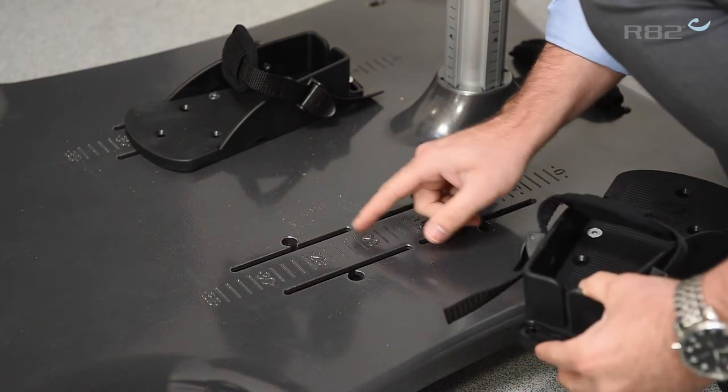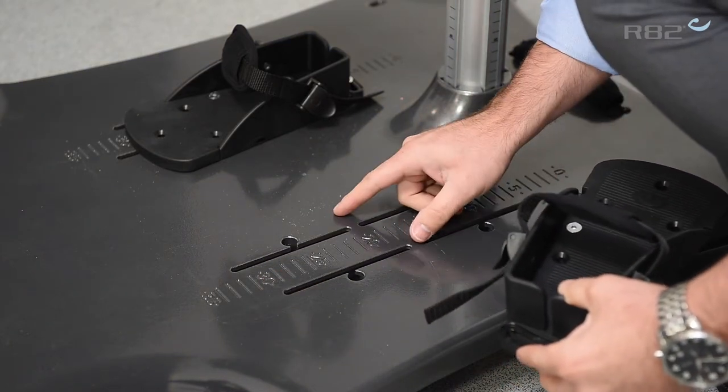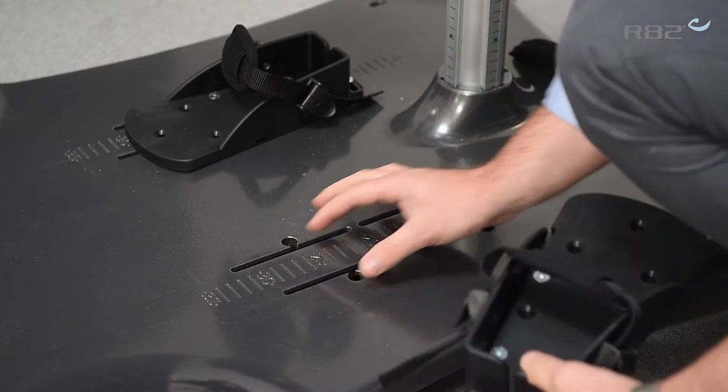And also for width adjustment you have two columns here, or two runners, so you can position again for width if you need more adjustment for the child.